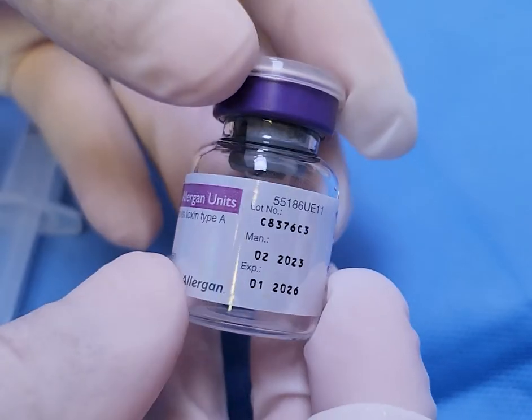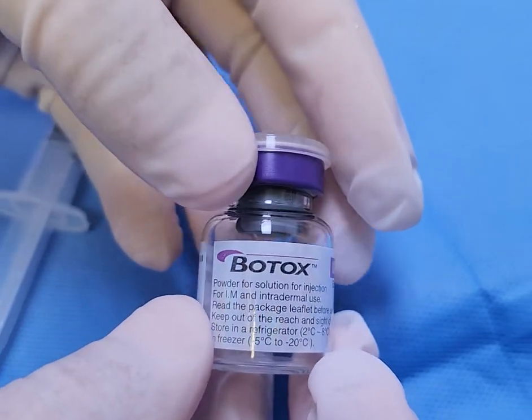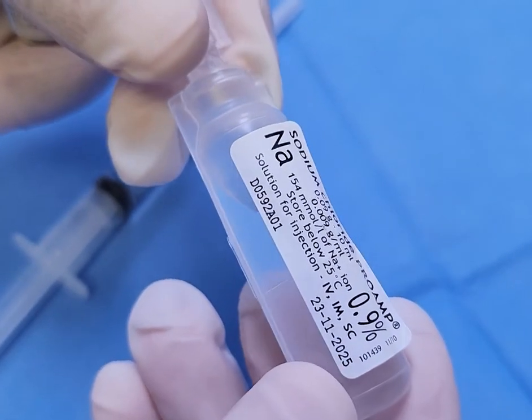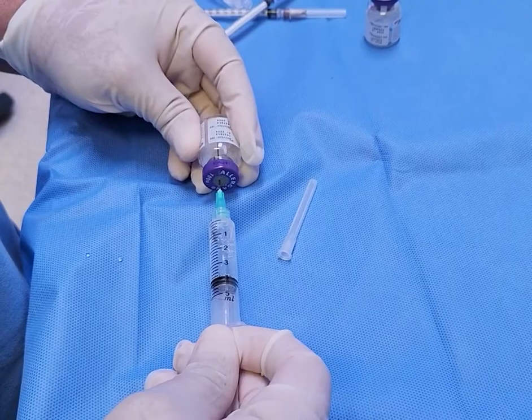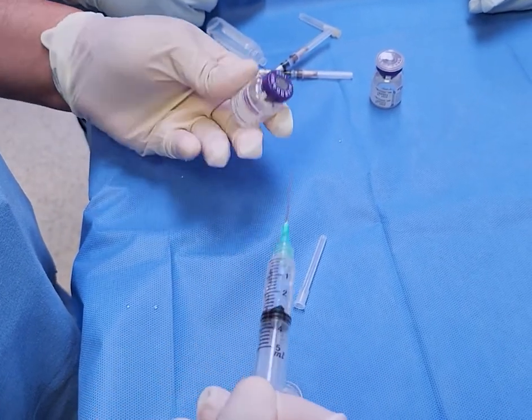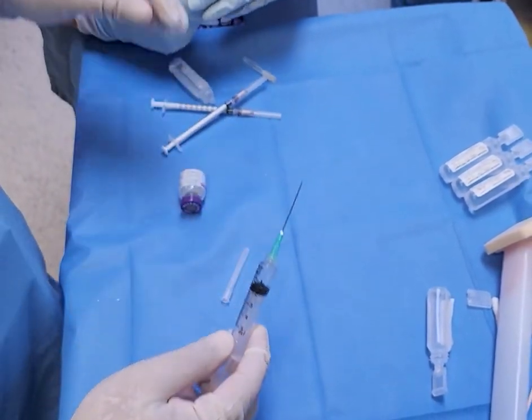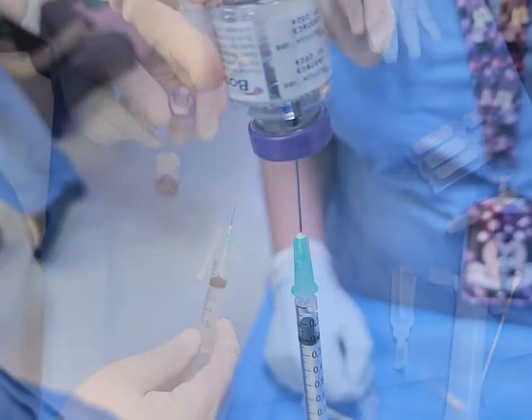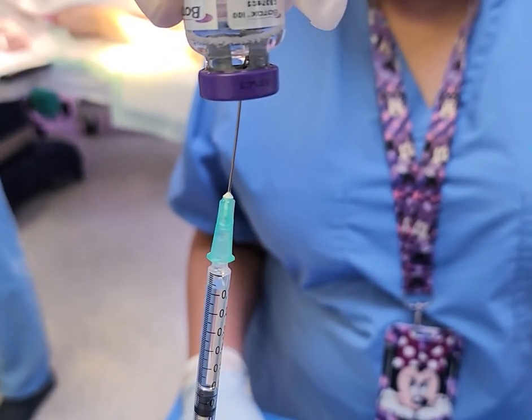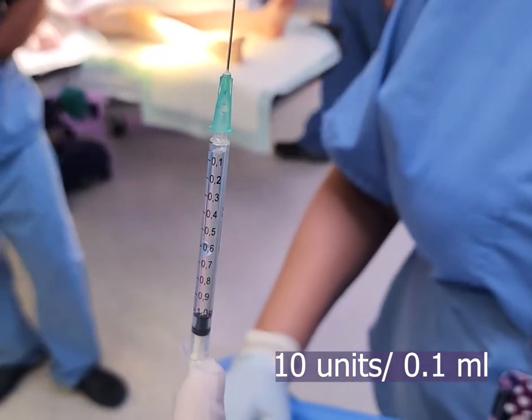This is the vial from Allergan, which comes in 100 units. I check the expiry date to make sure it's not expired, and I use normal saline 0.9% to reconstitute it. In this example, I wanted 300 units total, so I fill a syringe with 3 ml and put 1 ml in each vial — giving 100 units per 1 ml. I use an insulin syringe to aspirate the botox, which gives 10 units per 0.1 ml, making the calculation very easy.